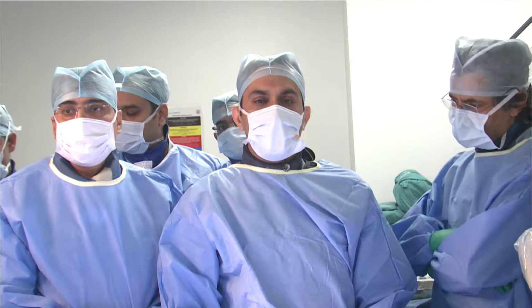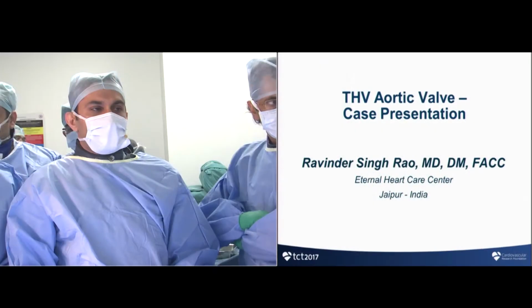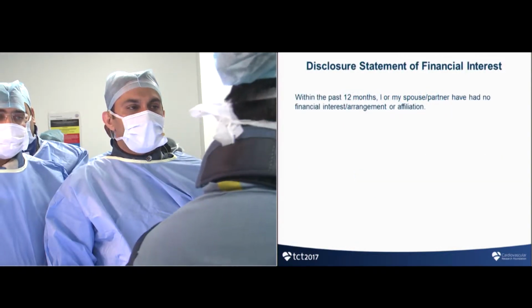And today we'll be showing a case of this novel transcatheter balloon expandable aortic valve implantation. So, transcatheter aortic valve case presentation. I have nothing to disclose.